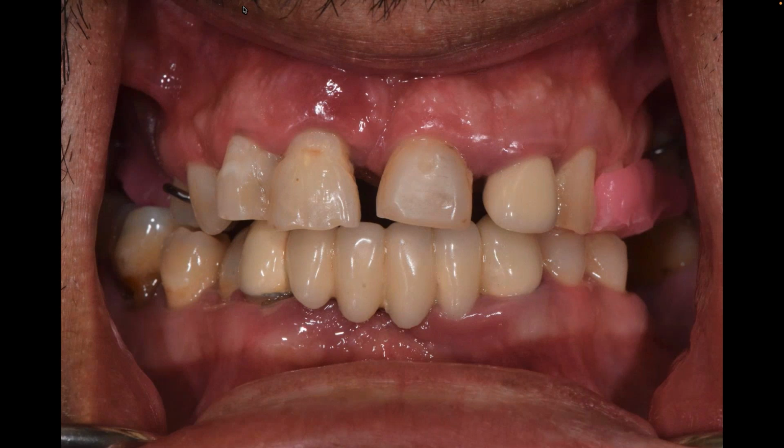And that's a common problem that a lot of times some colleagues encounter. Oh, I made the denture, I took the bites, but then I put in the dentures and the bite was completely off. Well, maybe it's because the CR was not recorded properly. Because once the teeth come out, that's all you have. It's the CR.